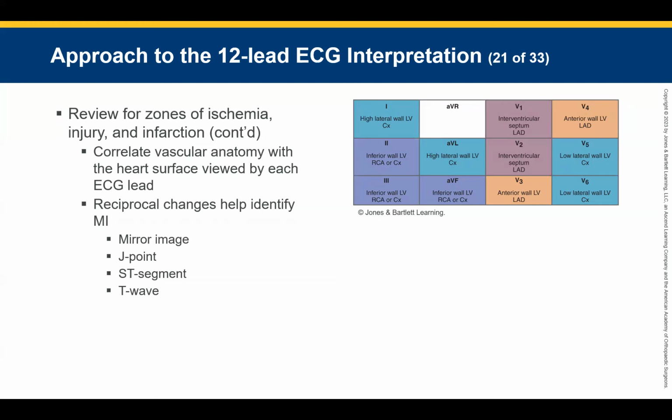Okay? Those two are the reciprocal changes we're going to focus on, on the front of the heart. There's something when we get to the back of the heart, a sign, but we're not there yet. This is it for reciprocal changes. Super important. You're on duty, right? We may not have class. Soak it in.